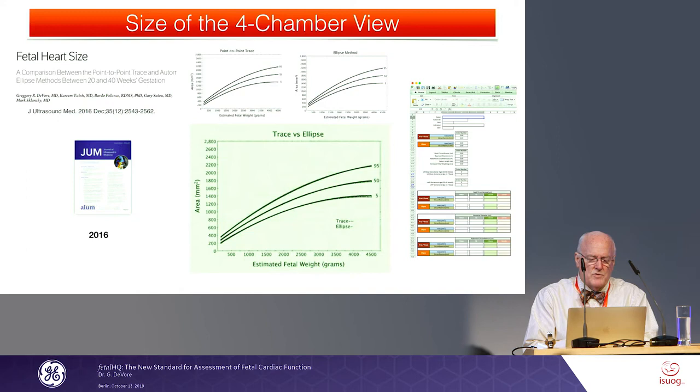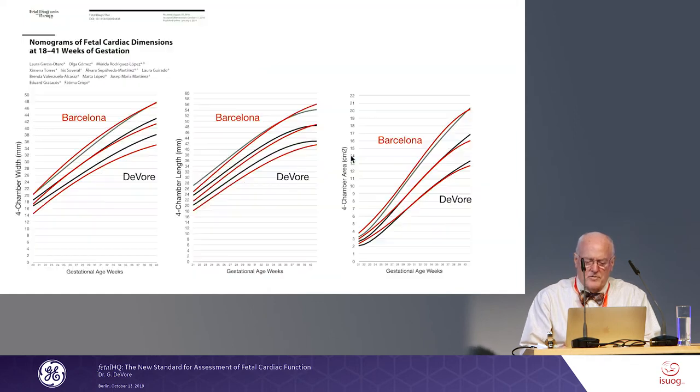Now, this just illustrates, for example, if we use the trace method, the ellipse method for the area, this is a curve superimposed one on top of the other. There was no difference whatsoever in our analysis. We also provided in the paper a calculator for doing so.